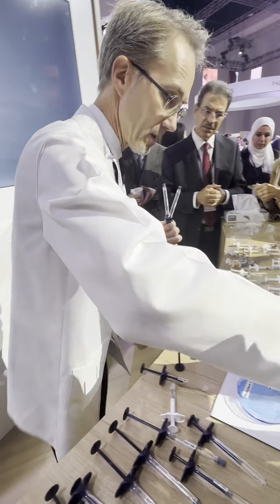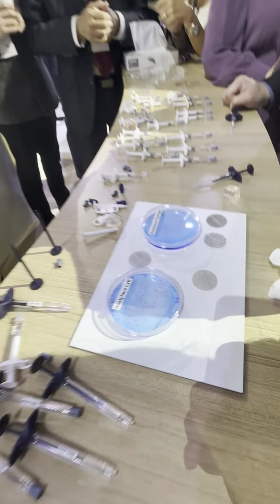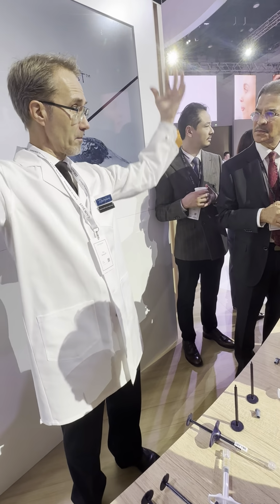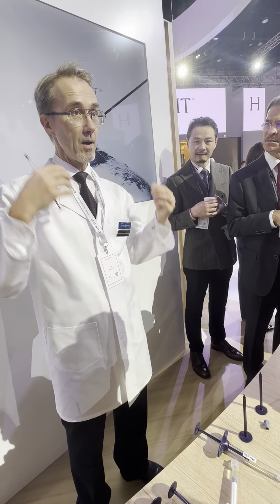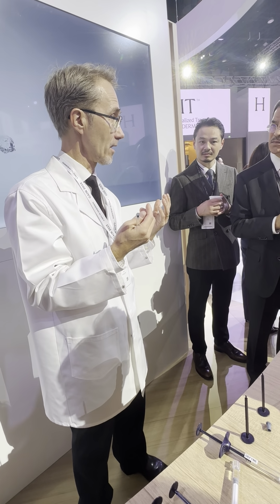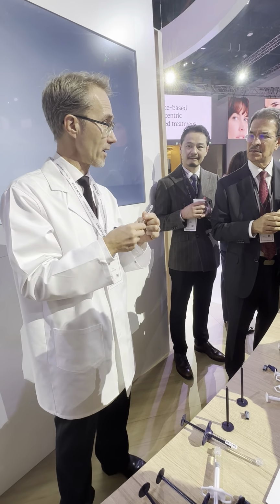So you can see it's a big difference. As a result, Restylane Volume contains very, very big gel particles, but is still easily injectable through a 27 gauge needle because of its softness. So we can feel the Restylane Volume.